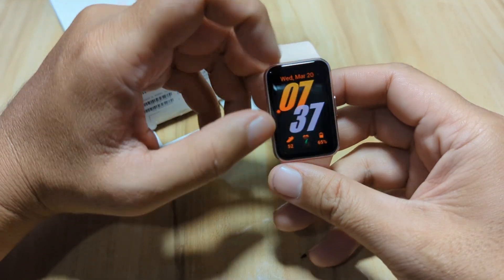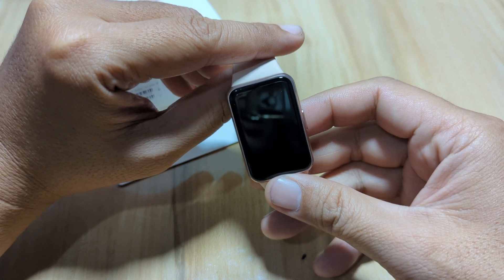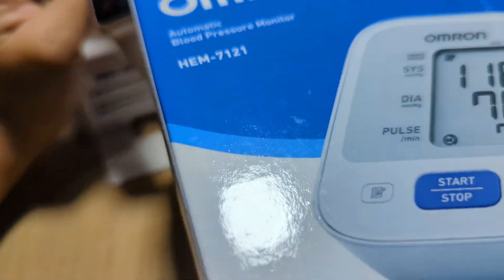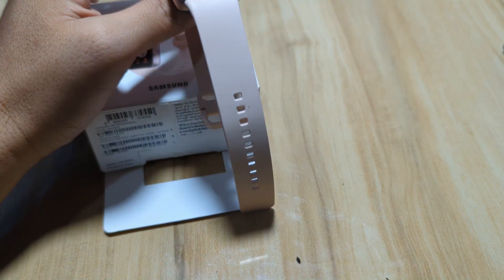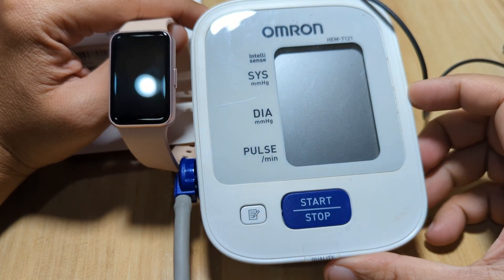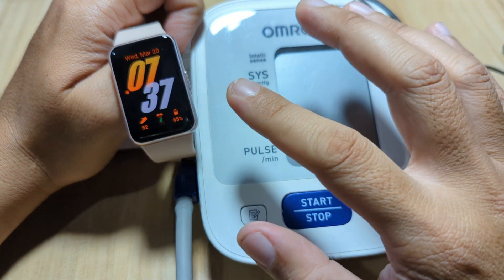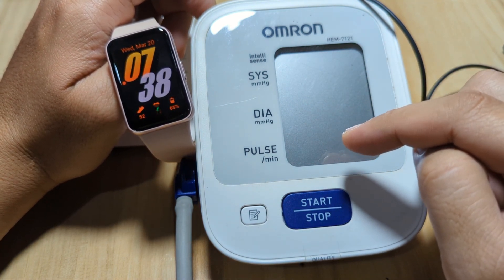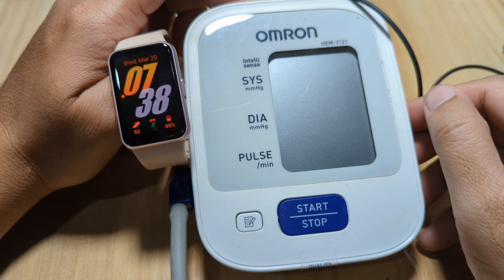There are some requests to compare it with a medical grade device just like we did with other wearables. So we have here our Omron blood pressure and pulse tracker or heart rate monitor checker — a medical grade device that can check our heart rate. We will check the Galaxy Fit 3 here and compare it with our Omron device, and we'll also have a simultaneous monitoring to check whether the result is close to our Omron or not.